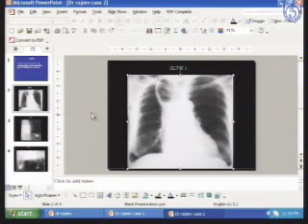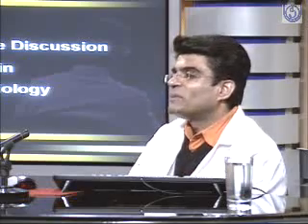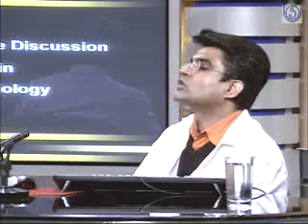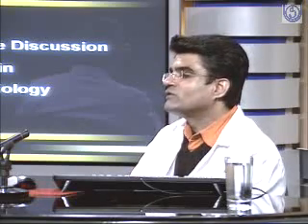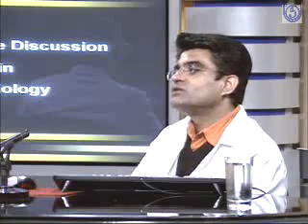After seeing the barium picture, we have reached the diagnosis of achalasia cardia. Is the student supposed to give a differential diagnosis at this stage, or should he dogmatically say this is achalasia cardia and it cannot be anything else? No, he should always first give a differential diagnosis. He should say, my top differential could be this, but I like to keep the following further differentials. Peptic stricture could be the second differential, or a complicated scleroderma. But scleroderma should not be kept in mind, because it is a very rare entity, not seen in day-to-day practice. But peptic stricture is common, where patients come with a history of GERD, gastroesophageal reflux disease, resulting in narrowing of the lower end of the esophagus, called peptic stricture, and that can also contribute to this. So always keep in mind the possibility of peptic stricture when you give a diagnosis of achalasia.